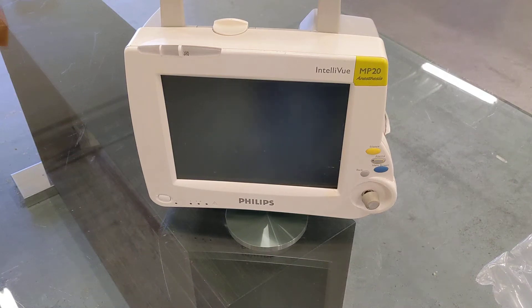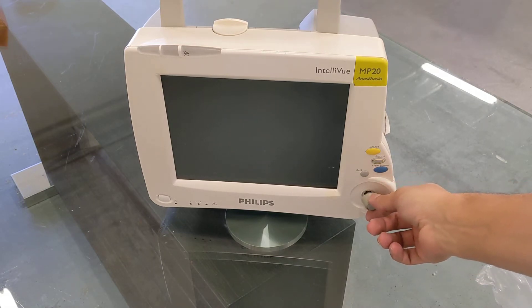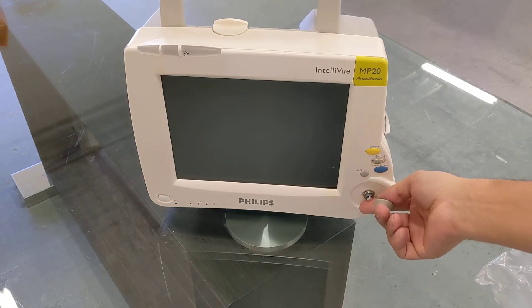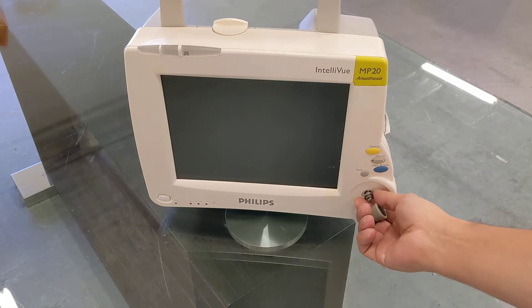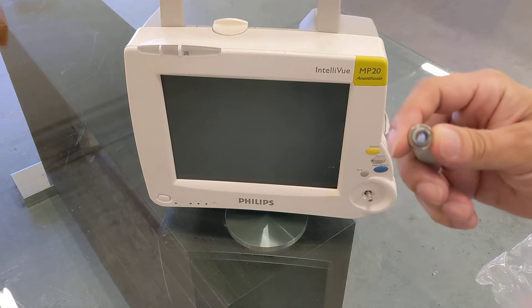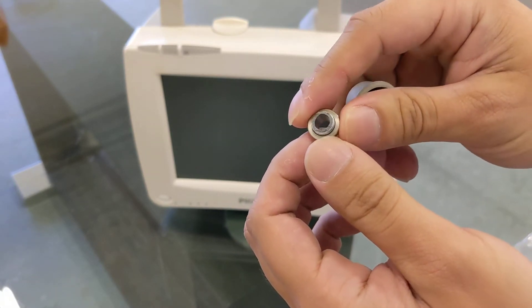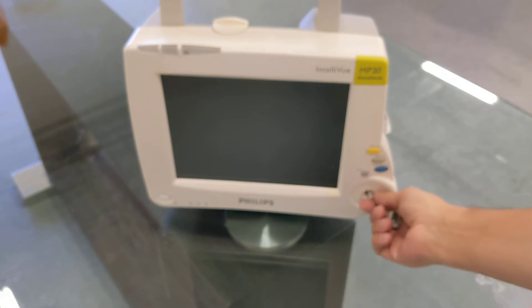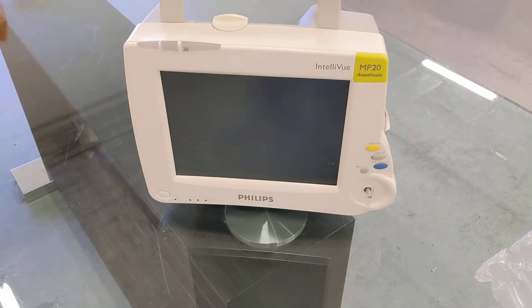Hey guys, we're back with another video. Today we have the Intelliview MP20 made by Philips. The reason we're making this video is because the little speed point knob was damaged via transportation. This little ring — looks like it's made of iron or some sort of metal — just completely broke off, so the push button does not work. We're here to fix it.